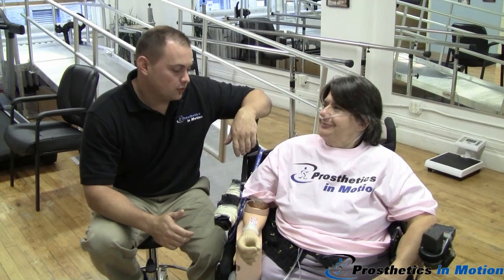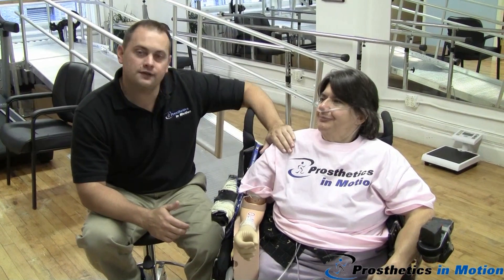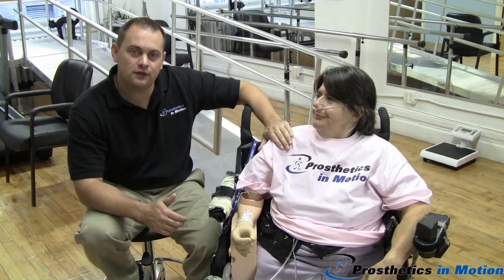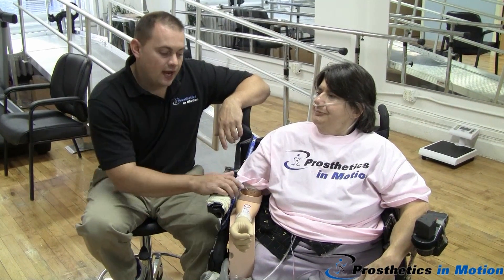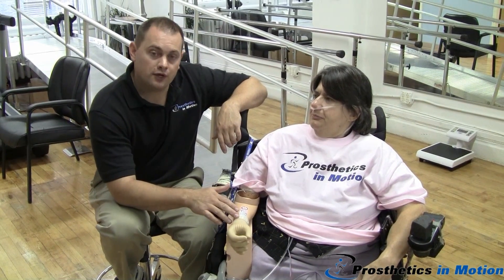Hi. Today we're here at Prosthetics in Motion. My name is Chris Court and this is Tex. Today Tex was fit with her first myoelectric prosthesis — this is the first day of her fitting. She has the dynamic arm from Ottobock, the sensor speed hand from Ottobock, and a wrist rotator.